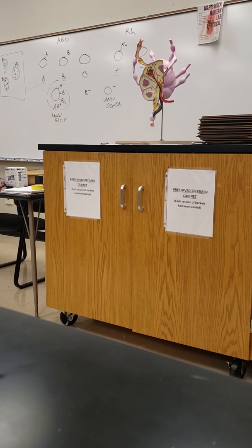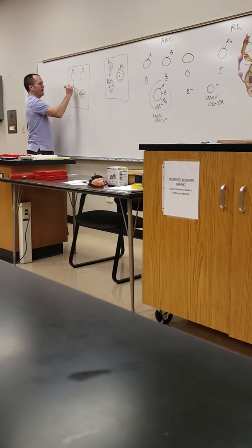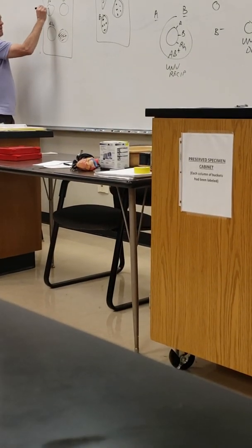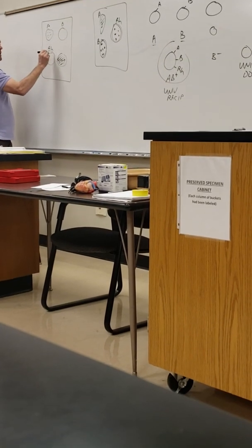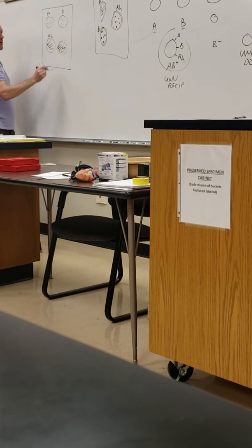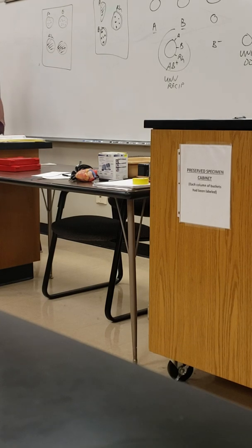Now, if you guys remember those, did you do your own blood types? Yes. Some classes did, some classes didn't. We had 4 things. This was the control right down here. So this should have always been just clear blood, right? Otherwise, it's the same. I think it was A, B, RH, like this. Doesn't matter what the orientation is. But these little speckles would form, right? Or you'd get smooth blood. What do we got? AB negative.